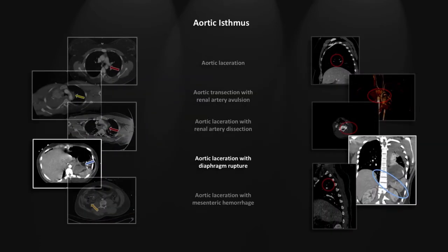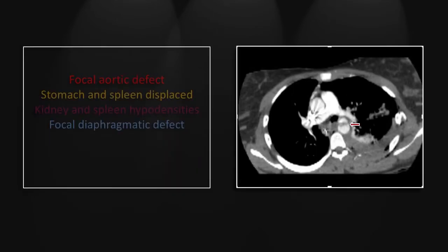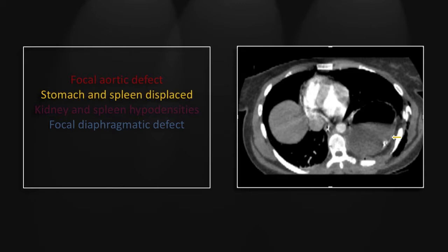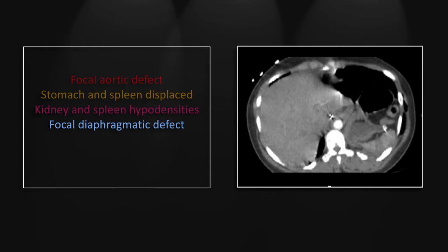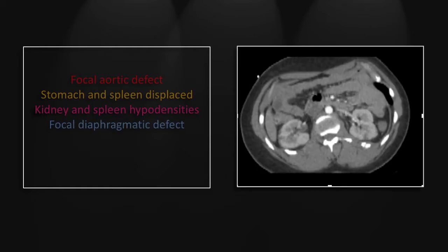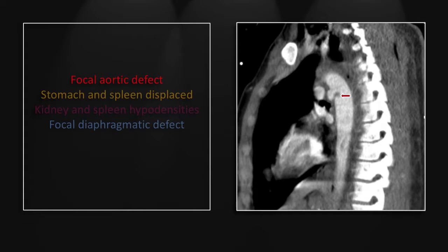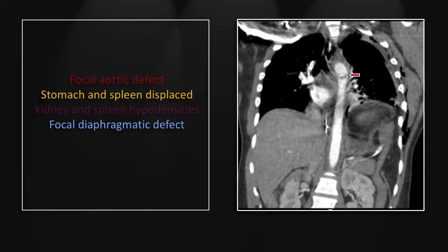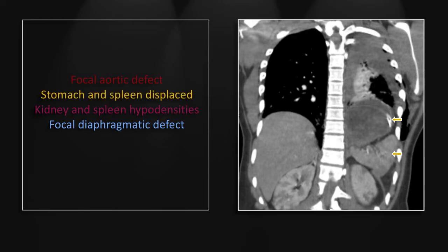Our next case is an aortic laceration with rupture of the left hemidiaphragm. You can see here the irregular defect in the aorta and here the herniated stomach lying in the inferior left hemithorax. The spleen has a well-circumscribed peripheral wedge-shaped hypodensity suggesting a thromboembolic event, and there is a defect in the anterior aspect of the left hemidiaphragm. The kidneys demonstrate the now familiar wedge-shaped cortical hypodensities again consistent with a proximal vascular injury and thromboembolism. There on the sagittal the intimal flap and pseudoaneurysm are more than obvious. Here on the coronal the intimal flap and the herniated colon and stomach and the free edge of the torn left hemidiaphragm. A cut further back shows herniated stomach and spleen — the spleen is rotated and almost appears inverted, lying above the torn edge of the hemidiaphragm.